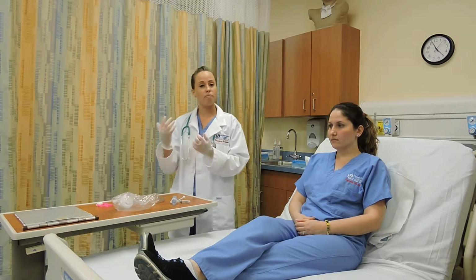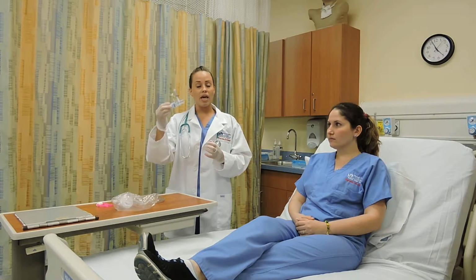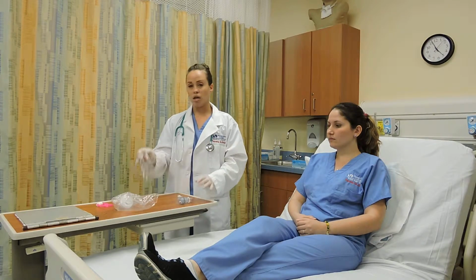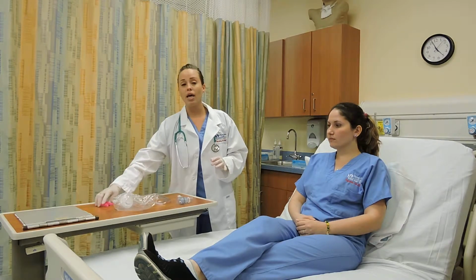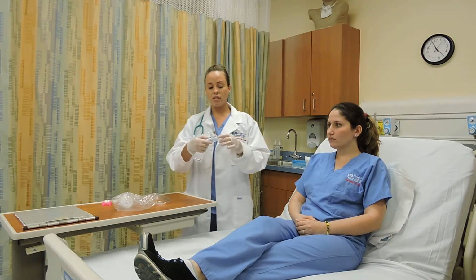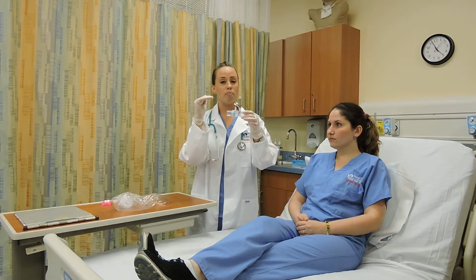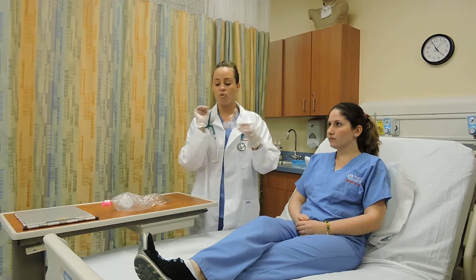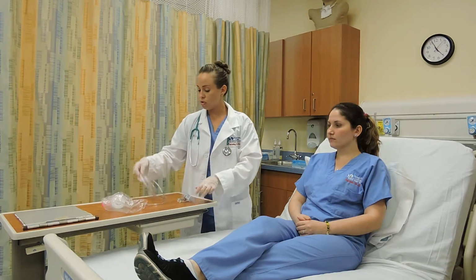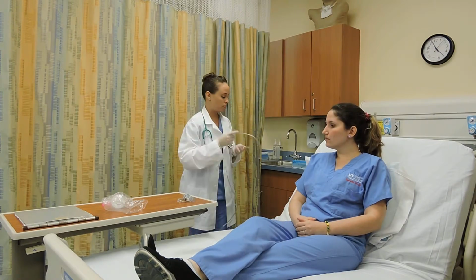To start the therapy, we're going to use, as I mentioned before, the EzPap, which you should gather prior to coming to the patient's room. An oxygen tubing and a nose clip also are going to be necessary. This equipment consists of a manometer, which is going to tell me if the patient achieves an airway pressure of 10 to 20 centimeters of water, and a mouthpiece. I'm going to proceed to connect my oxygen tubing to the flow meter.